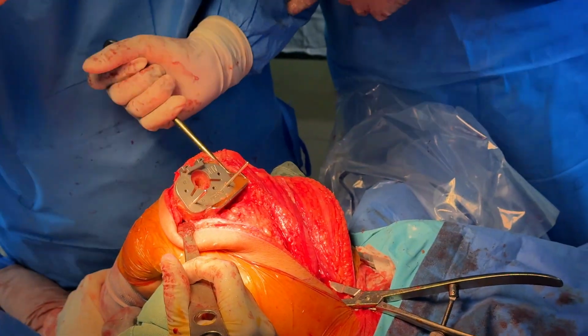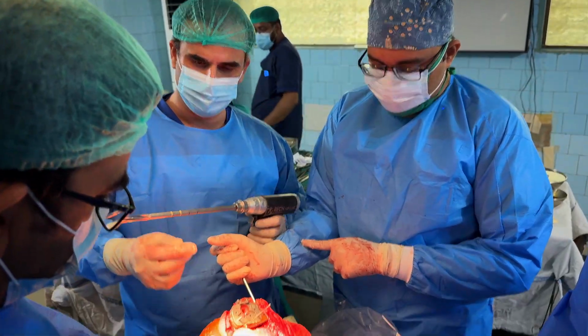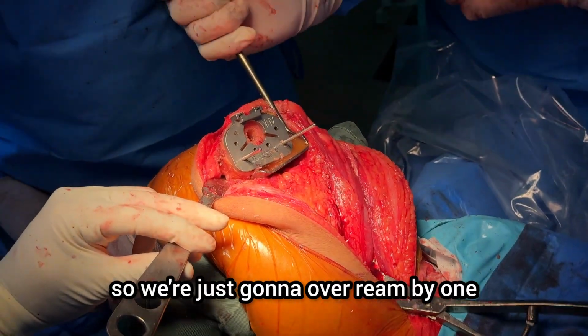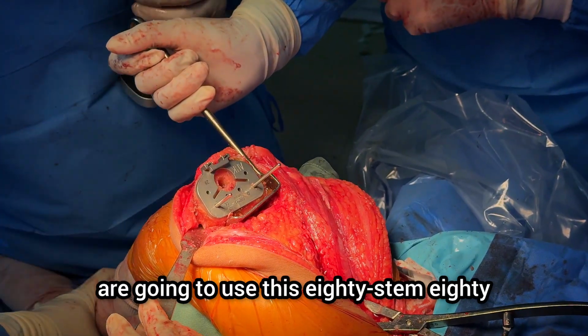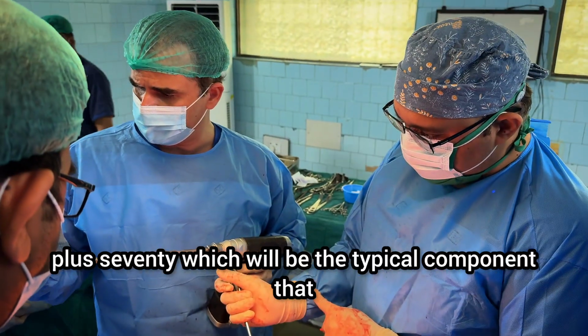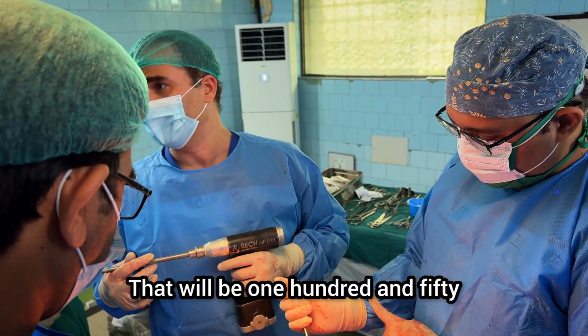Brush off. So basically now we're finishing off the tibial preparation. Sequentially reaming up. This is size 11. So we're just going to over ream by 1. Having reamed 12, we'll insert a 10. And we're going to use this 80 stem. 80 plus 70 for the tibial component, so it ends up with 150. It'll be 150.